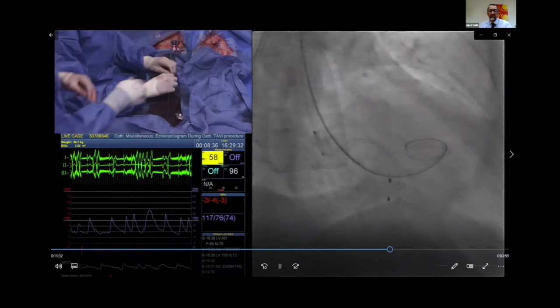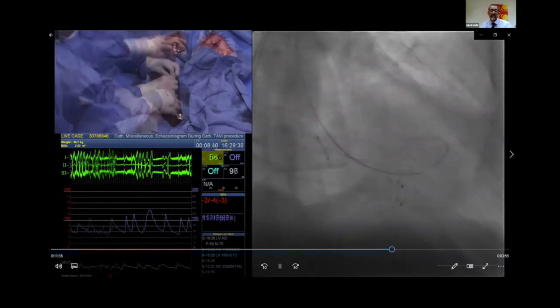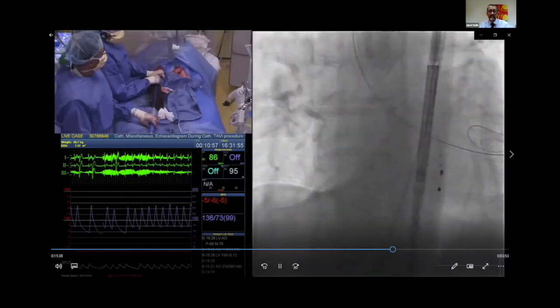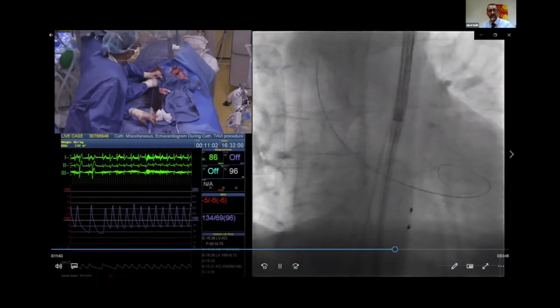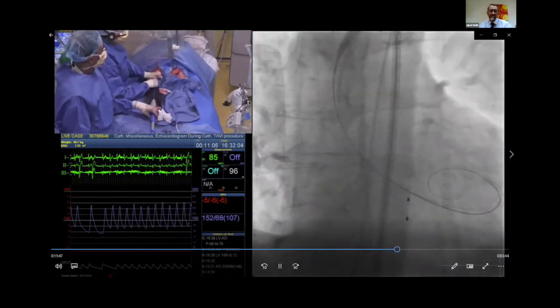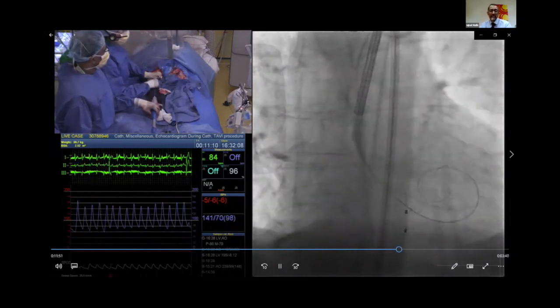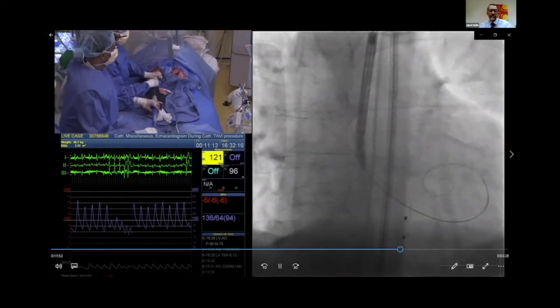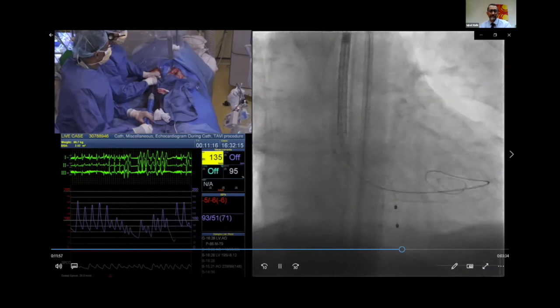And so you can see we're trying to get a Safari wire, a stiff wire, other manufacturers are available, into the left ventricular apex. And then we're using an Evolut valve because he had quite a lot of LVOT calcification. One of the reasons for choosing one valve against another is that LVOT chalk. You might push that with a balloon catheter into an unfortunate position in the aortic root and cause an aortic root trauma.